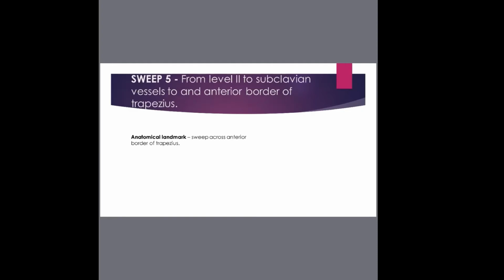So if you're writing a report to an ENT surgeon, and you say there's a lymphadenopathy in the neck, they will really appreciate it if you mention the level, because that guides them to know which organ to focus on. So that's why it is important for you to classify these lymph nodes.